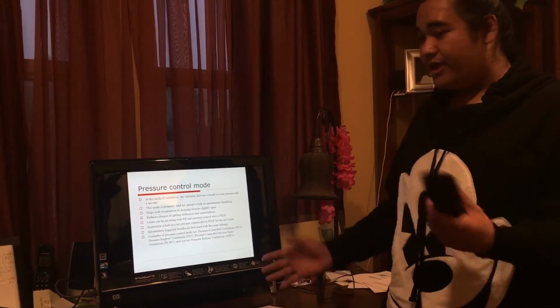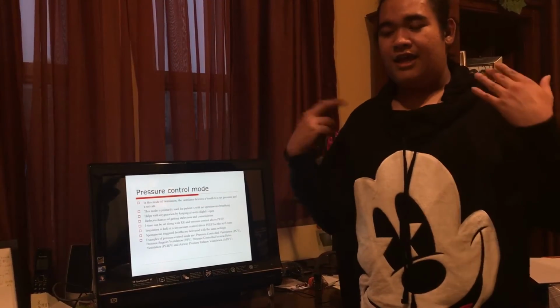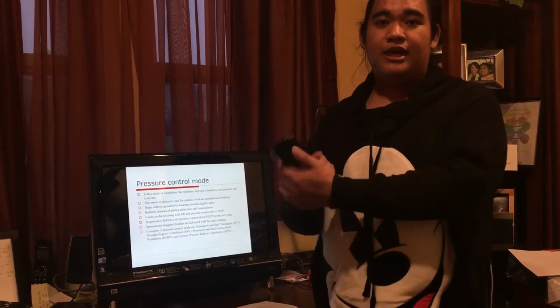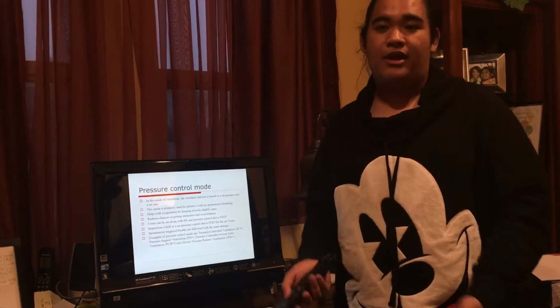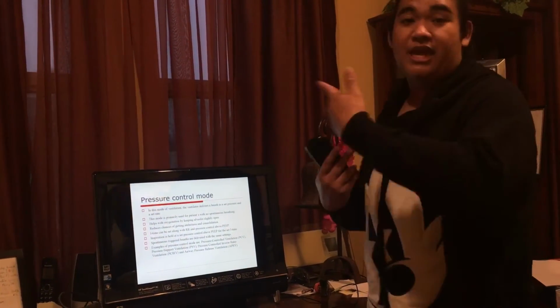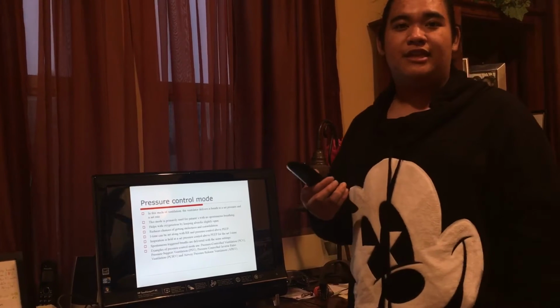So the way the mechanical ventilator works is trial and error. It's like everything in this world. If one doesn't work, then we can switch to the other. That's why they created a lot of modes, to help with the patient's comfort and synchronizing with the vent. That way, we can ensure that we are not creating any lung injuries or making them worse, and as much as possible, we try to keep them from staying on the ventilator.